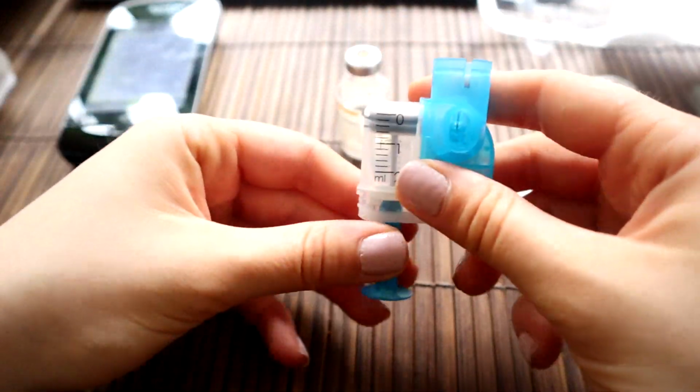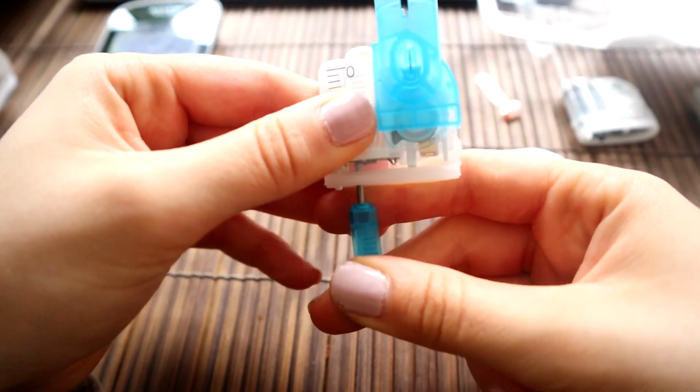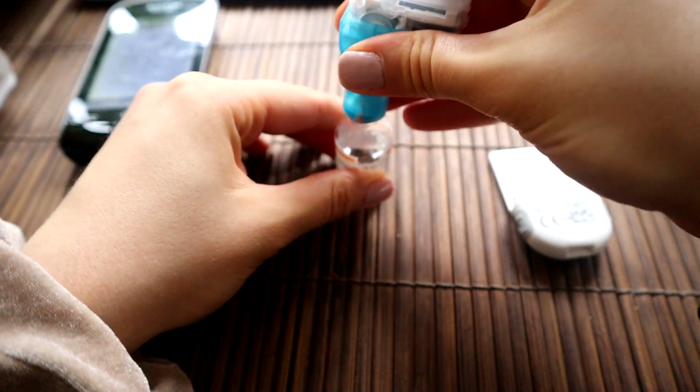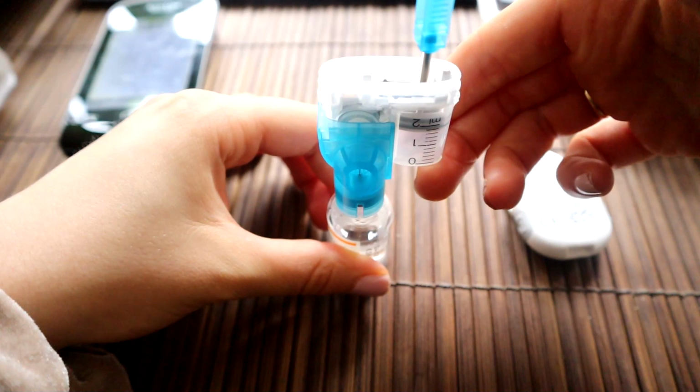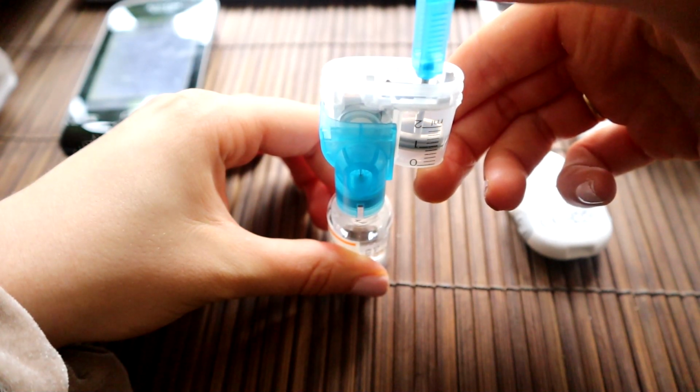So you have to pull the plunger all the way out to fill it with air, put it on top of the insulin, and then push the plunger all the way down.